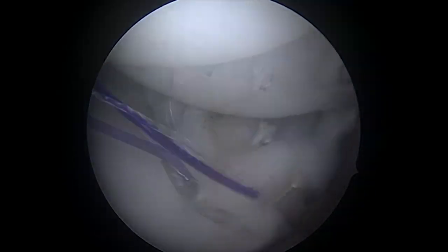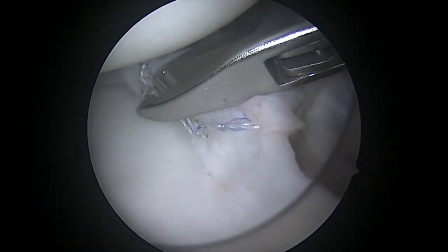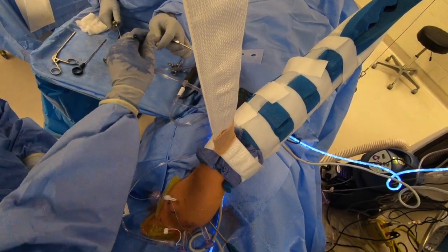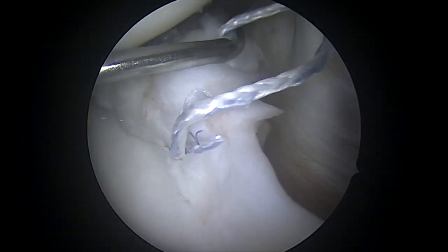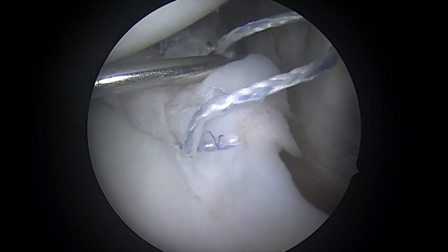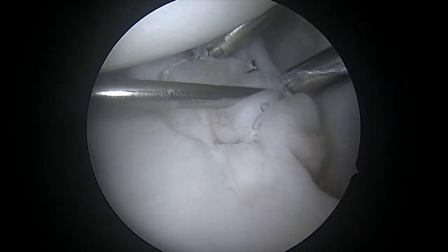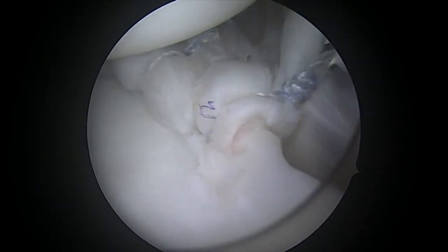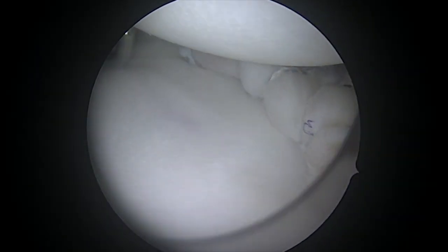We'll get that all passed — you can see this is our final suture being passed. We want to try to get a nice spread of those sutures, so you see me using a probe to get that suture dressed correctly so when the knot comes down, we don't end up with a dog ear in the tissue. That spreads the sutures across the tissue, tries to get an even bigger bumper and bite. You can see how nicely it creates a bumper and also retensions the anterior inferior glenohumeral ligament all the way across the front of the socket. This will stabilize the shoulder and lead to a happy patient.